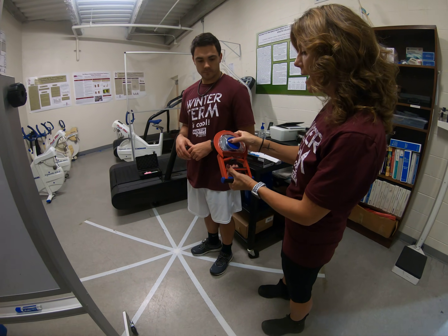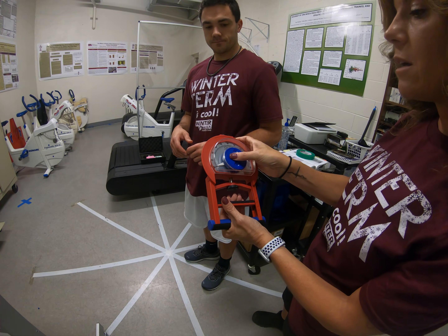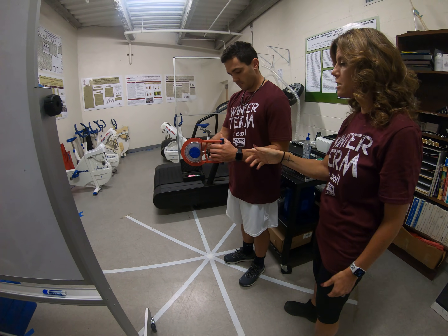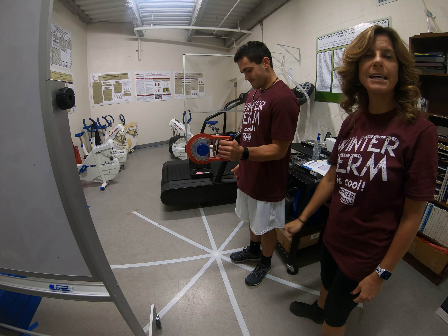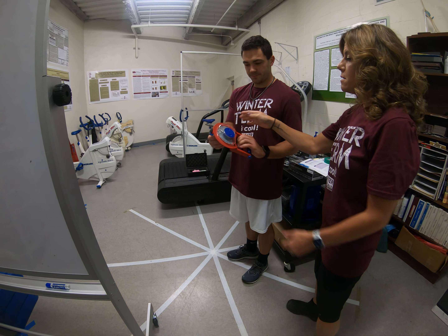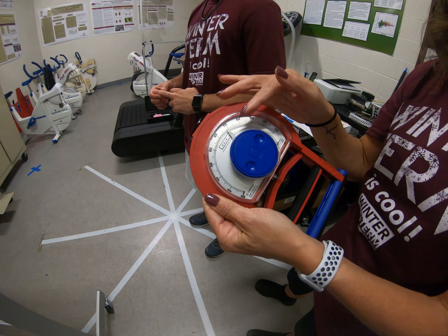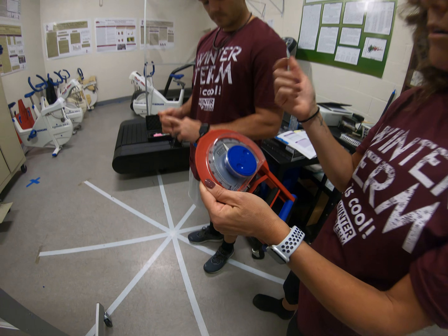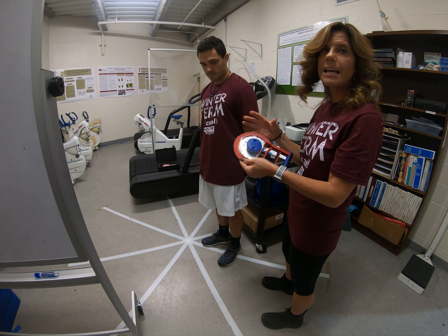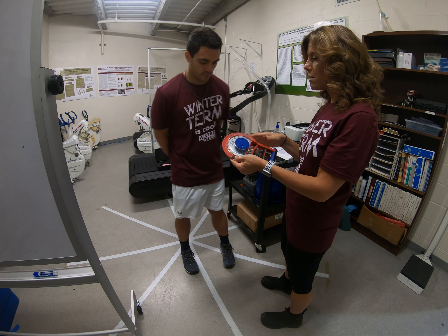We will calibrate it again back to zero and we will hand it back to the client, have them comfortably put it in their hands, squeeze it as hard as they can again without holding their breath, and then we will put that number down in our assessment — 58 kilograms as we can see here.